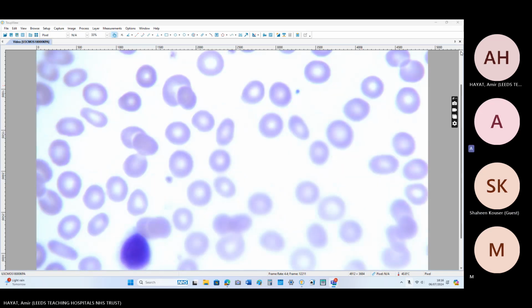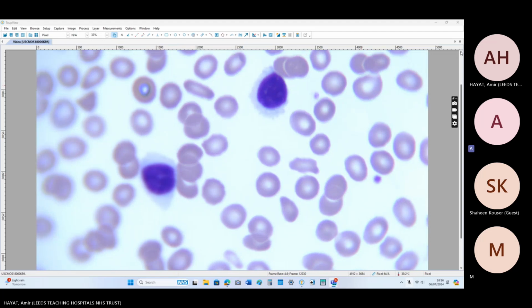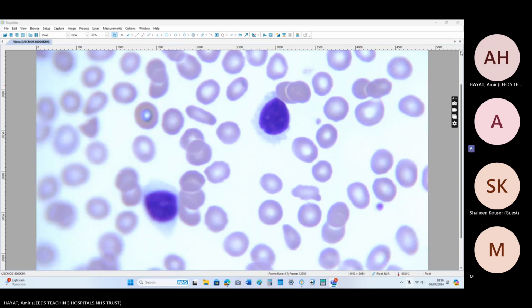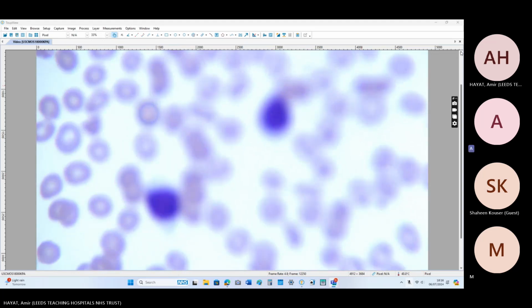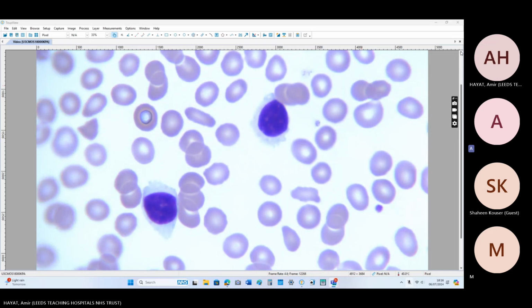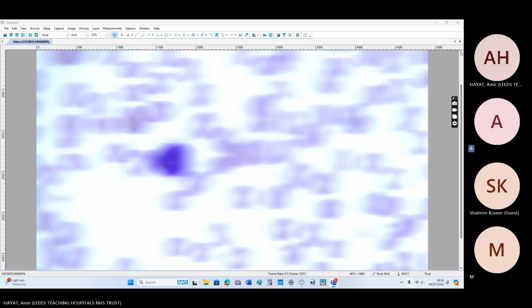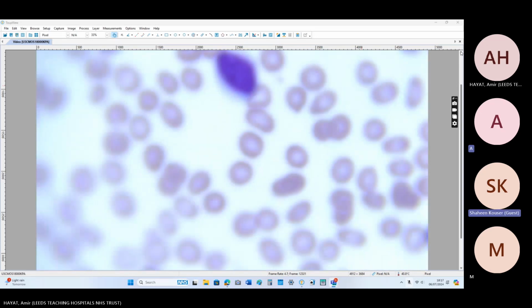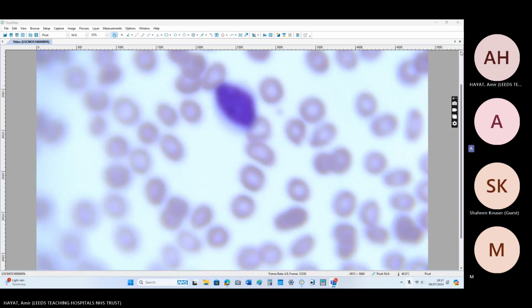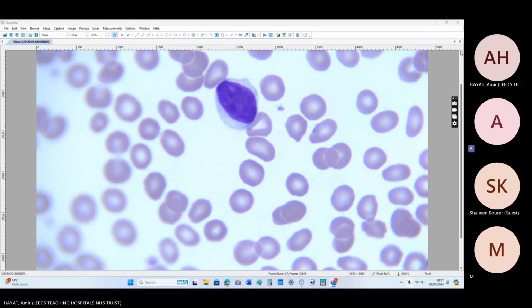There is lymphocytosis with small to medium size lymphocytes with abundant cytoplasm. However, the cytoplasm is showing projections. Chromatin is quite clumped. Nuclear contour is regular. Nucleolus is present in few.